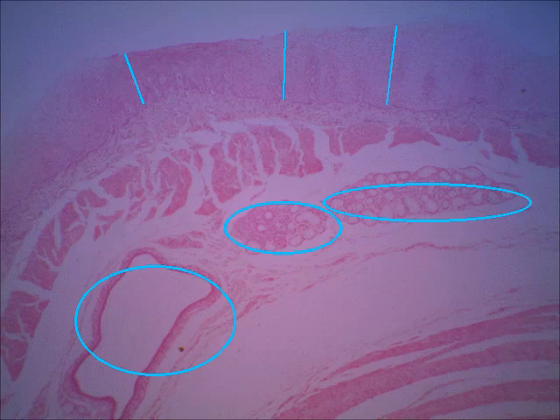You don't see where it goes up onto the surface, but it's got to be sectioned just right for that. But for the lab recognition, you need to recognize that in the esophagus, you're going to have the non-keratinized stratified squamous epithelium for the mucosa, and then within the submucosa, you might see these lightly stained mucus glands. So if we look at some other views on this same slide, this one's on scanning.